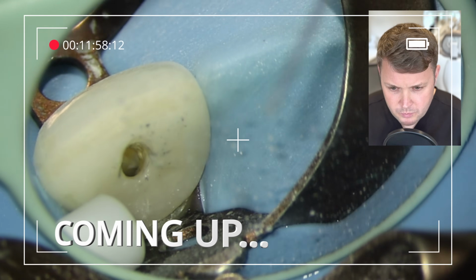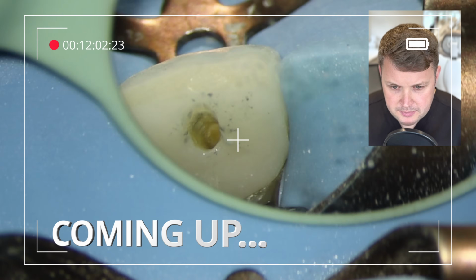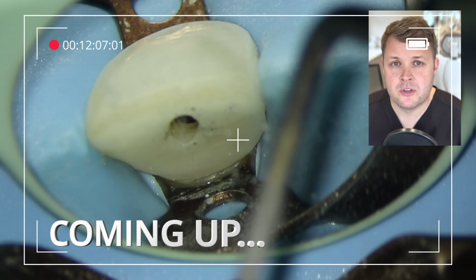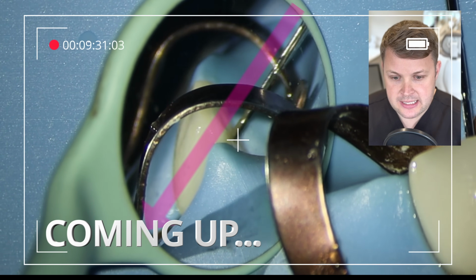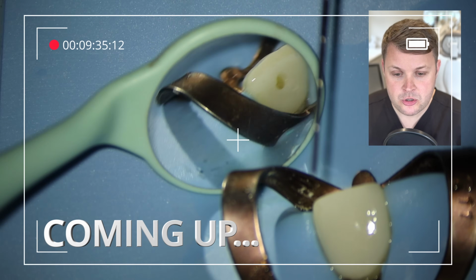Just checking here with the refinement. And I don't want to remove too much of the palatal surface of the crown, but I do want straight line access. I am angulating my burr in the wrong direction, so if we draw a little bit of an arrow here, we can see that if we were to drill any further, this is going to go out of the tooth buccally.